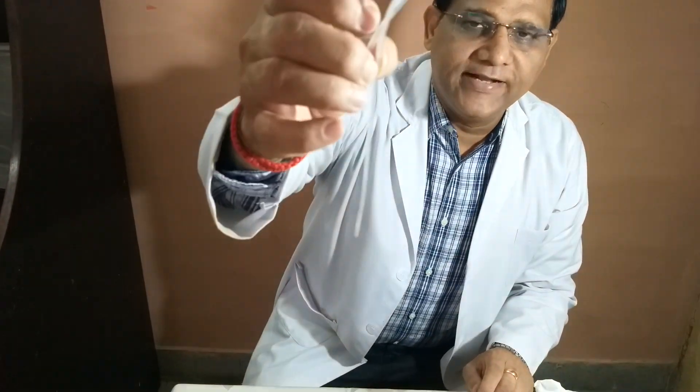First I would like to tell you the various instruments you use while doing a venous cutdown. You should have betadine, then 2% xylocaine, tooth forceps, a scalpel with BP handle, a suture cutting needle, suture cutting scissors, a mosquito clamp, a needle holder, an infant feeding tube, silk suture material, a syringe, and a dressing set.